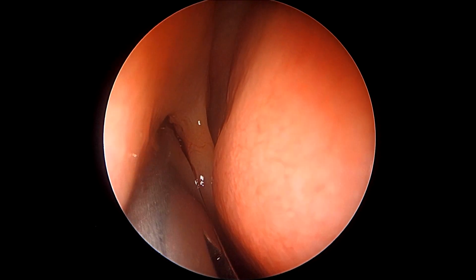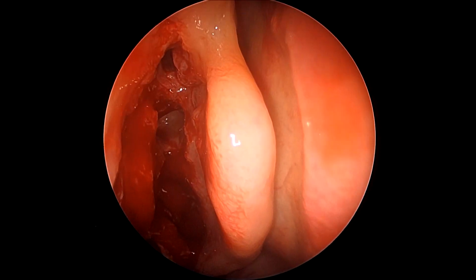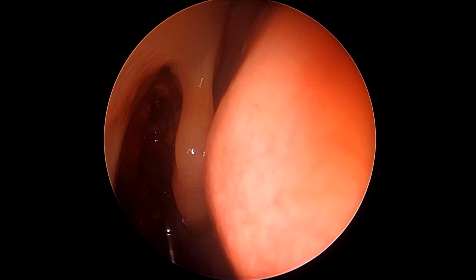Here we're using the same Hajek-Kofler punch to slightly increase our access towards the frontal recess, removing the anterior bone of the agger nasi as high anteriorly as we can.